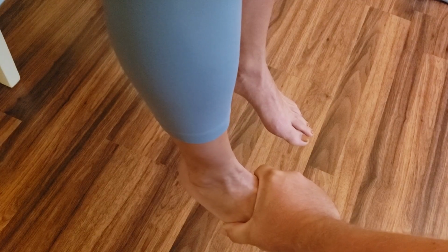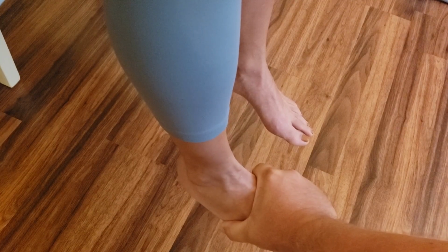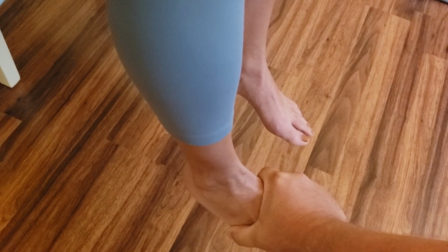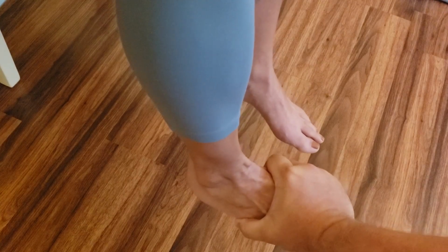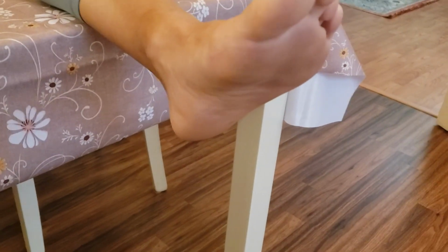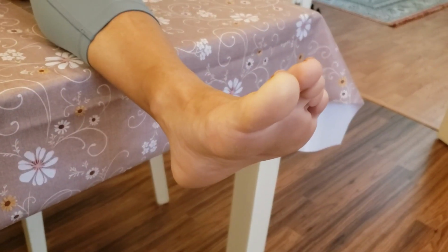I'm going to say, push, push, push, and if I'm able to, I'm going to actually bend your foot down, but you're going to give me all you got. Ready? And go. Push, push, push, push. Very good. Had a lot of trouble breaking her, so I'm going to rate her a 5 out of 5 on that. So this next test we're going to do is a handheld dynamometry.